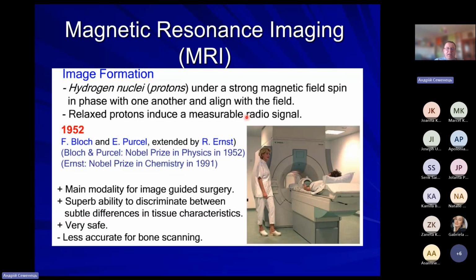Now, very briefly about other kinds of tomography like MRI or PET or SPECT. The fundamental difference for those types of tomographs is physical principles: what kind of signals they register, what kind of energy they react to.